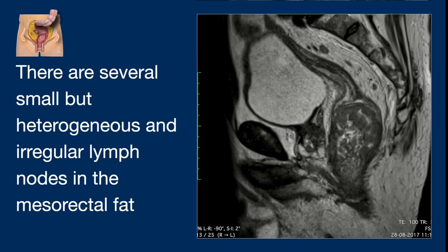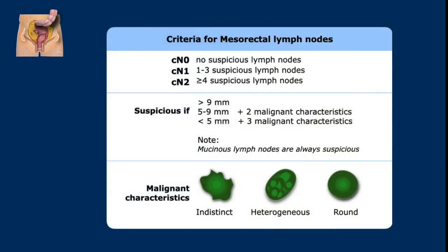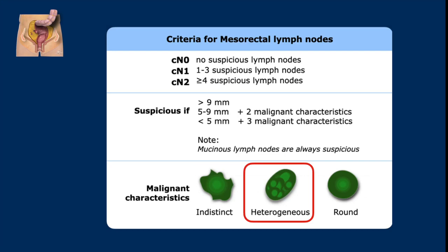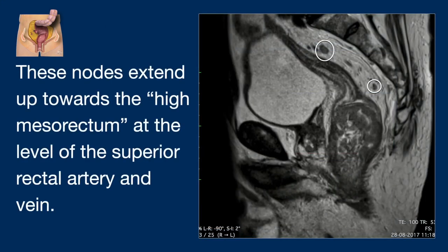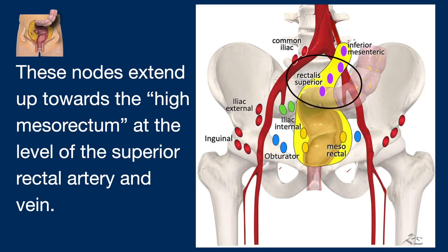There are several suspicious lymph nodes because they are heterogeneous and irregular, located in the mesorectal fat. Mesorectal lymph nodes are suspicious when they have malignant characteristics — an indistinct border, heterogeneous texture, or round shape. When they have these three malignant characteristics, even nodes smaller than 5 mm are suspicious. Nodes between 5 and 9 mm only need two malignant characteristics, and lymph nodes larger than 9 mm or mucinous nodes are always suspicious. These nodes extend up towards the high mesorectum at the level of the superior rectal artery and vein, which is important information for surgery or irradiation.